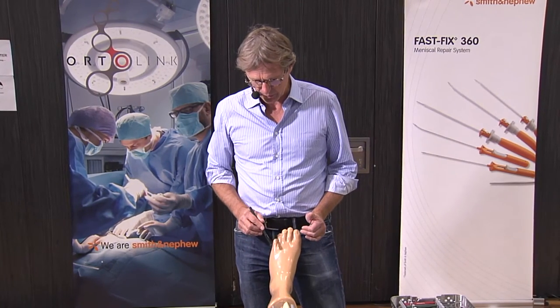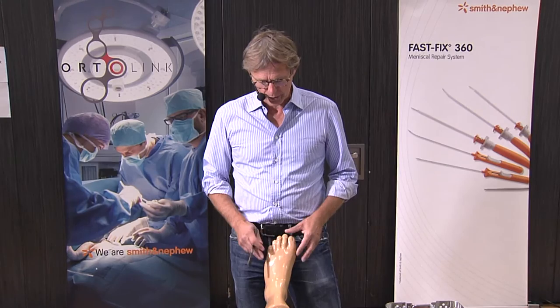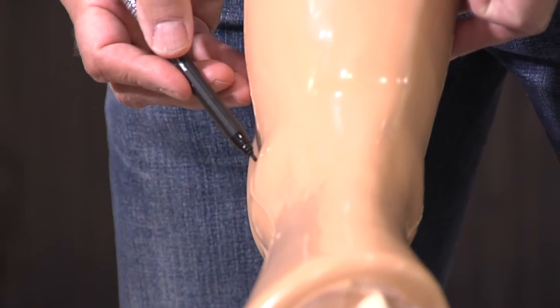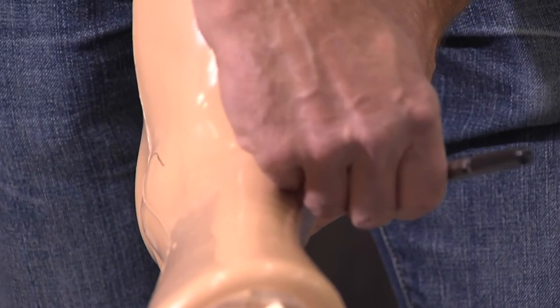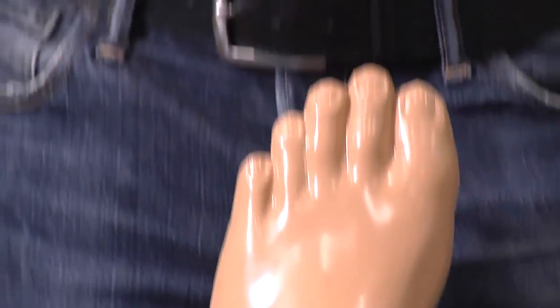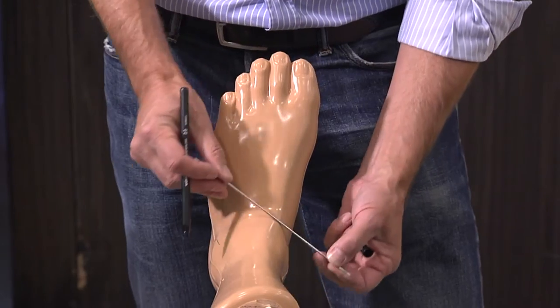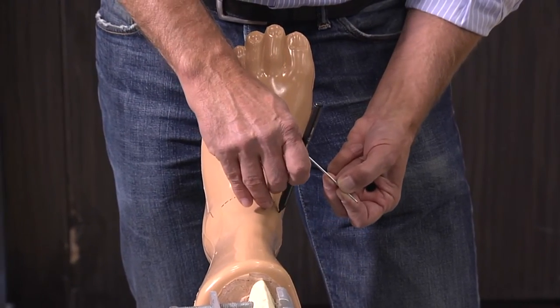What you start with is the anatomy from the outside, because that determines where you have to go inside. You palpate the fibula — the fibula is here on the outside. You can palpate this is the tip of the fibula, and then it goes here in front and at the back. What is important is to find the tip of the medial malleolus. The tip of the medial malleolus is here, then it goes in front. If you know the tip of the medial malleolus, then you know the level of the ankle joint — one and a half to two centimeters proximal is the level of the ankle joint.